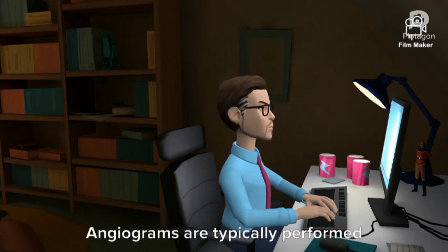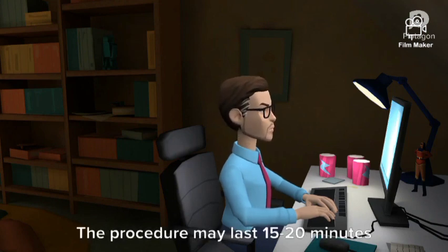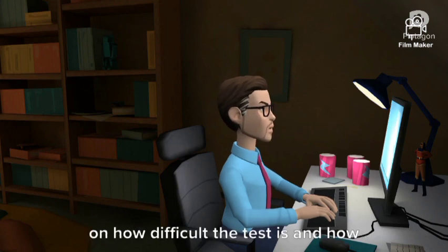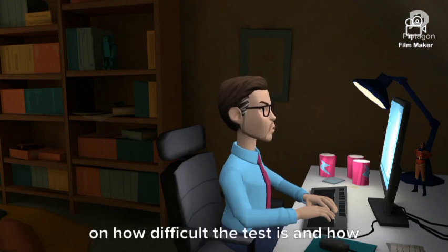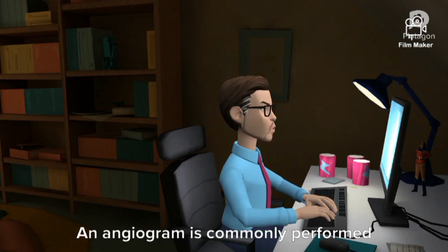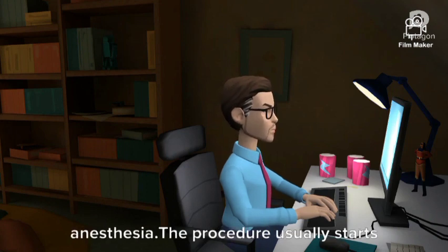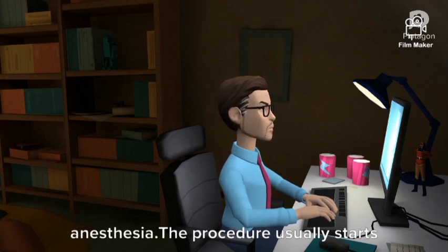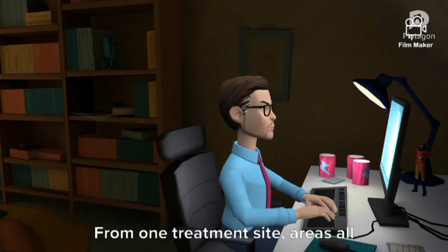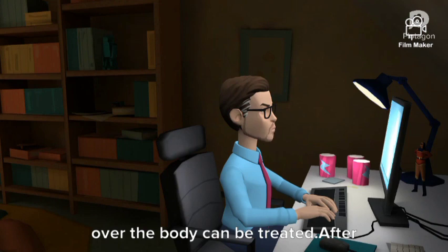Angiograms are typically performed while the patient is sedated. The procedure may last 15 to 20 minutes or up to several hours, depending on how difficult the test is and how much treatment is given. An angiogram is commonly performed under sedation with the use of local anesthesia. The procedure usually starts with a needle put into the femoral groin artery. From one treatment site, areas all over the body can be treated.